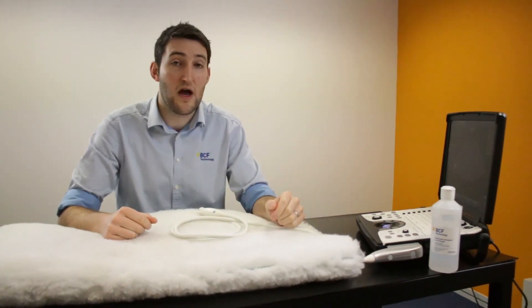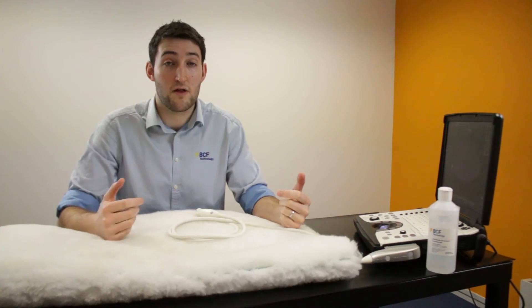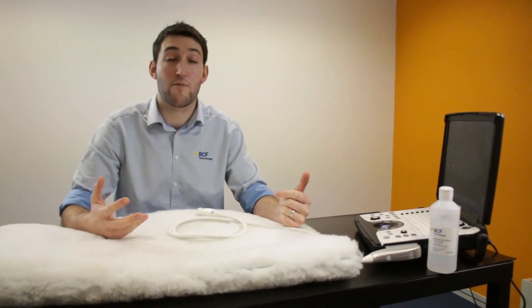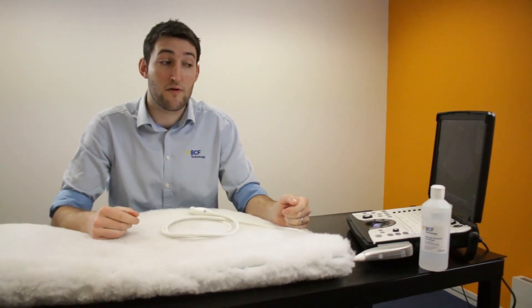Also bear in mind it's worth making an effort to save the images as you go. Most new ultrasound machines will have a capacity for storing images on a hard drive and exporting them via a USB or similar, and they can then go on to the clinical records.